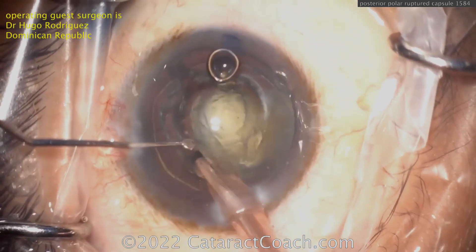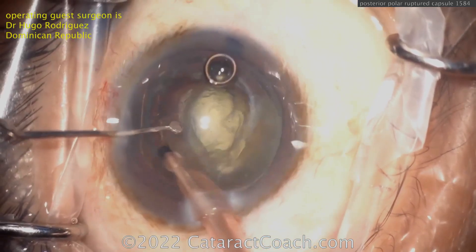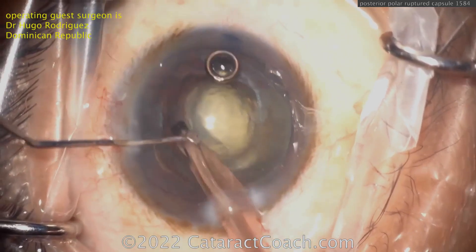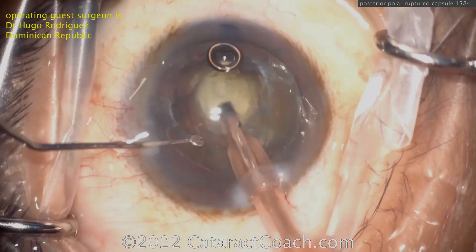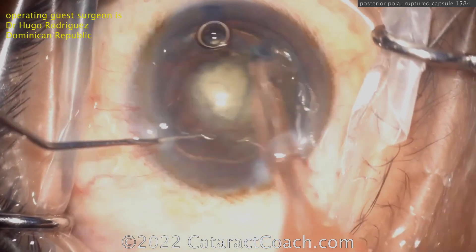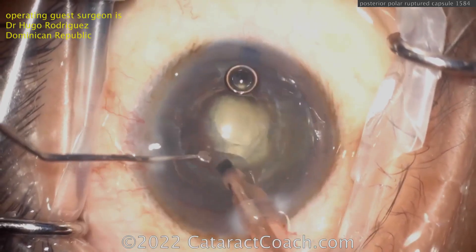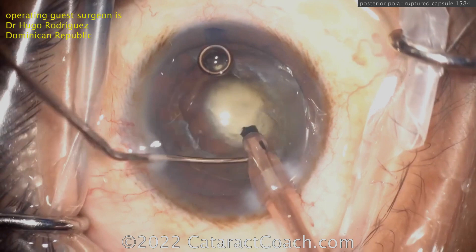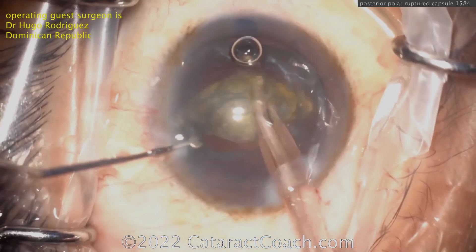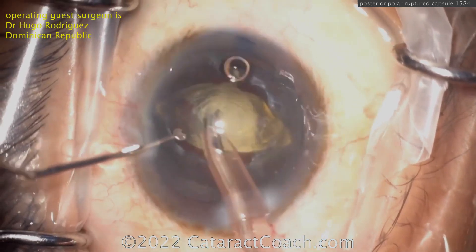Cleaning up and removing the endonucleus from the eye — it comes out pretty easily, so not too dense a cataract. Usually posterior polar patients have had this since birth, but it tends to worsen in their 40s and into their 50s and 60s, when the opacity spreads wider and affects vision enough that they seek treatment. If you see this in someone who's 20 years old and it's smaller with still-good vision, you don't have to do surgery just yet. He's very carefully getting that endonucleus out of the bag — beautiful technique here. Dr. Hugo Rodriguez from the Dominican Republic. Fantastic job.